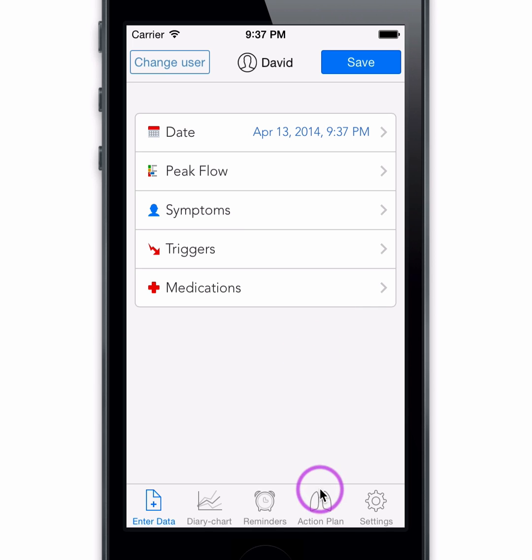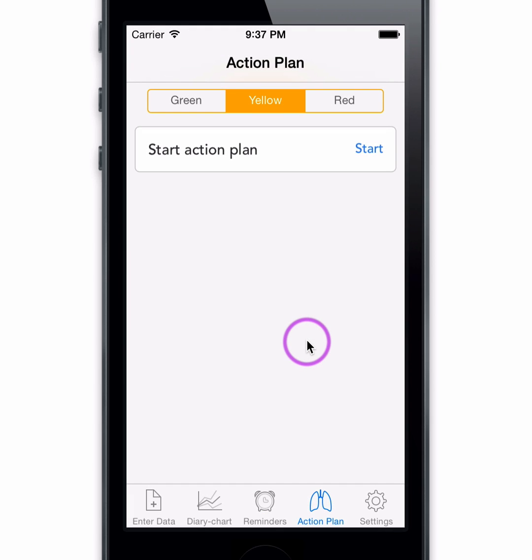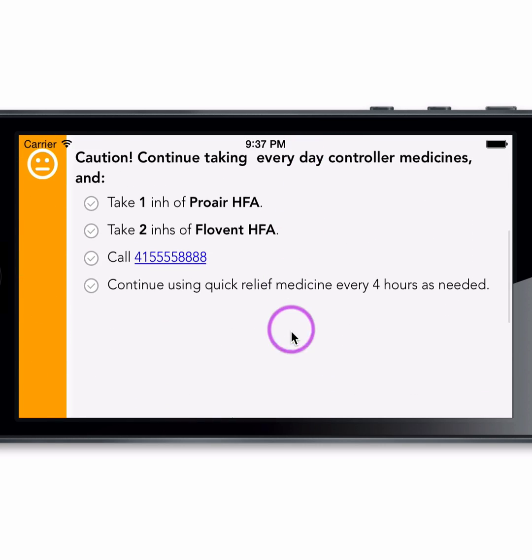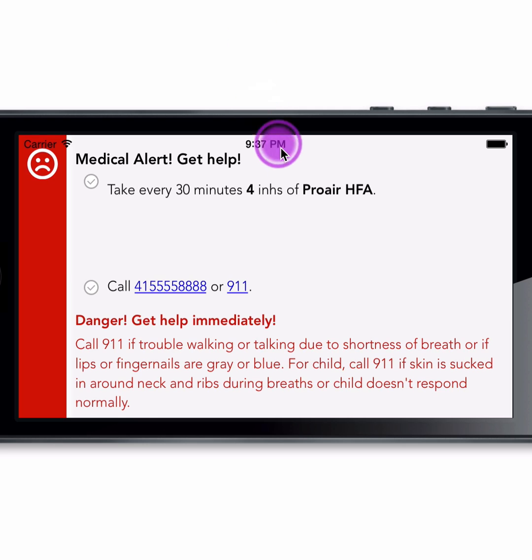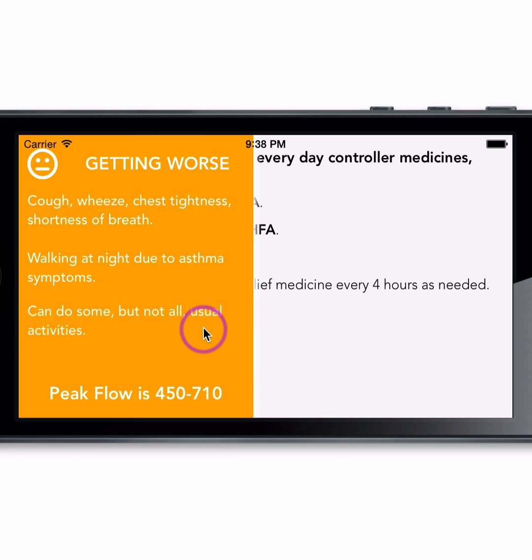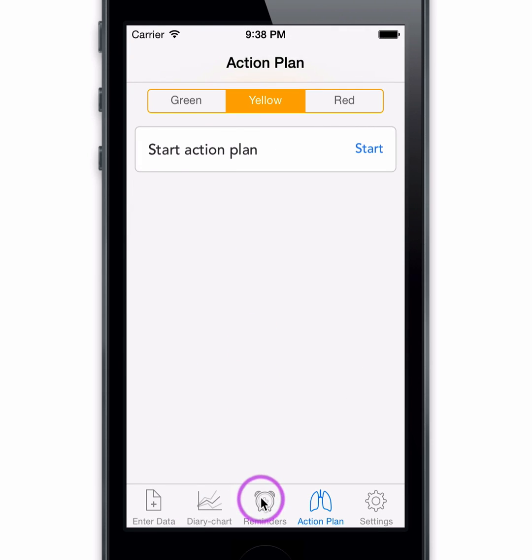The action plan tab is a dual-mode screen. Holding the phone vertically will display our patent-pending interactive mode that we will demonstrate later, and in the horizontal position you can view the full action plan. You can scroll up and down to see all three zones, and tap the color sidebar to get more information about each zone. Tap the white side to collapse, then return to vertical position to navigate out.